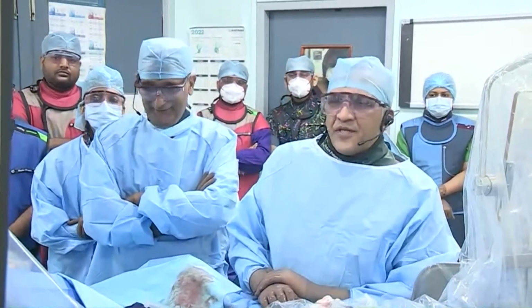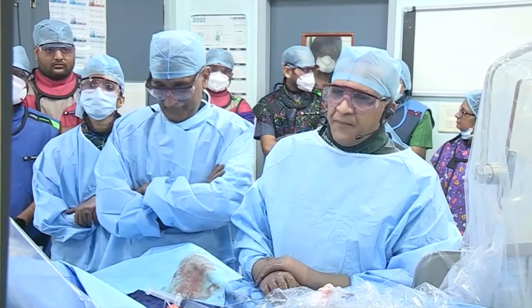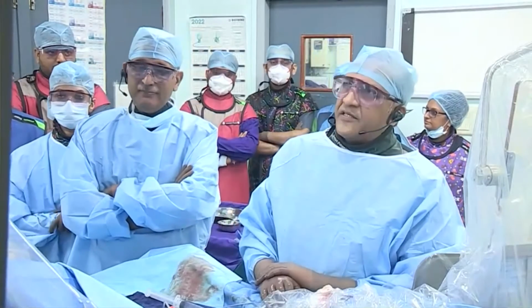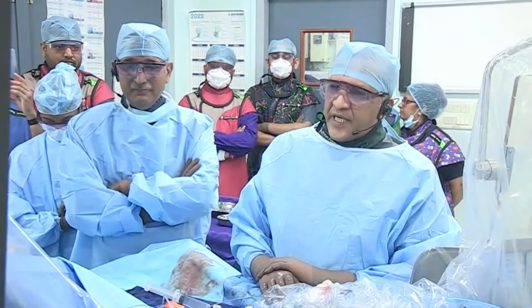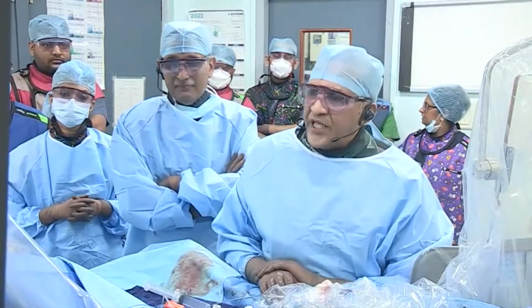Hi, Minister. So this is a 66-year-old gentleman who had recent classic angina, which reduced his effort tolerance. CT calcium score was more than 2,000, and echo was normal. His risk factors include hypertension and type 2 diabetes mellitus, well controlled. HB 13.6, creatinine 0.9, good counts, LDL 85 on statins, LP little a 40.